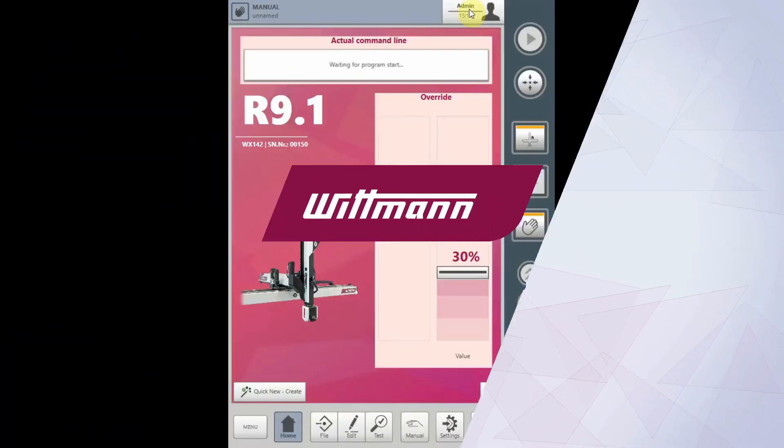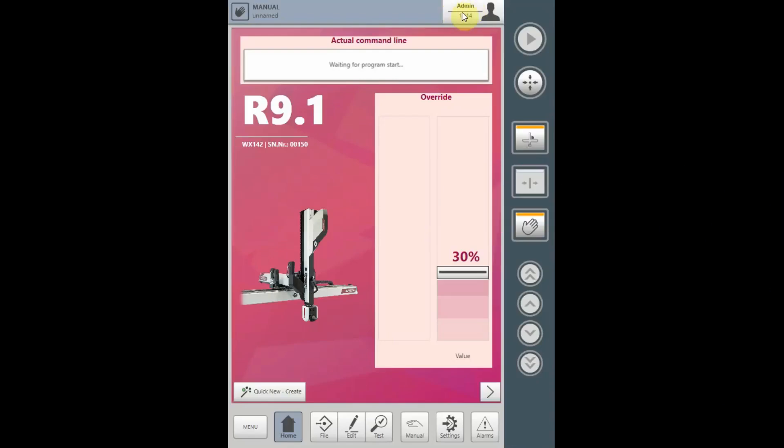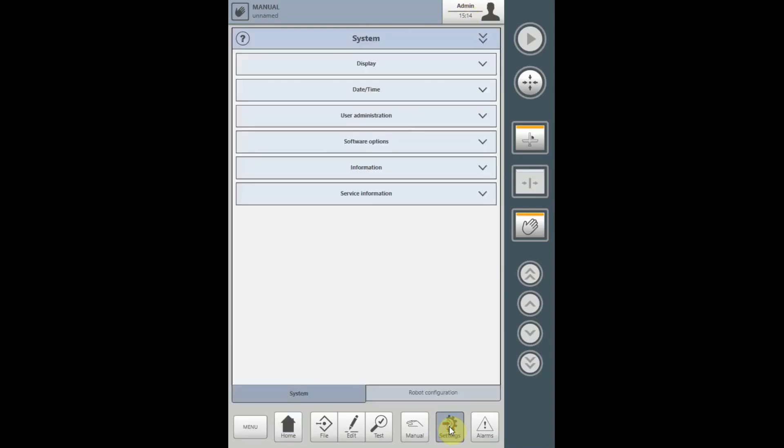The Administrator, when logged in, has the ability to adjust and change certain items on the display. To do this, select the Settings tab, then select System.